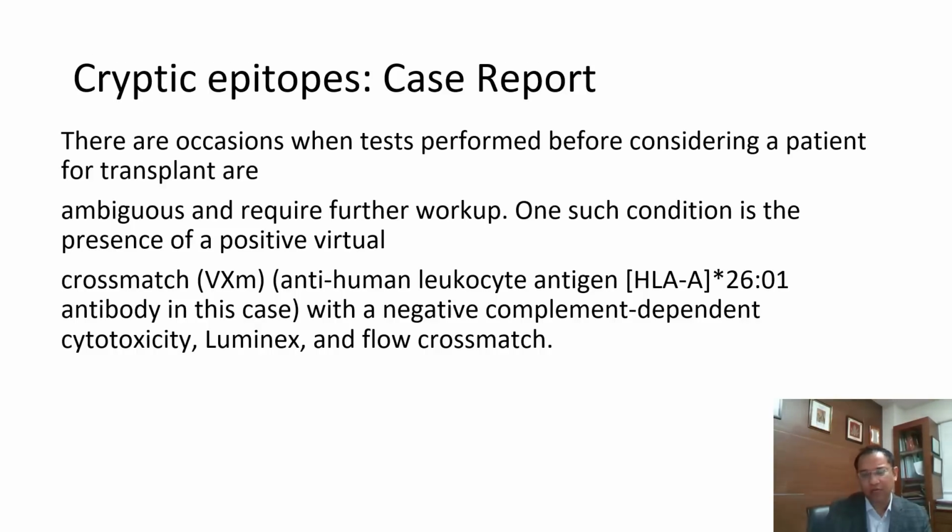And then we also saw that all the other beads were also coming positive. Many beads were coming positive, which were actually negative when you saw the flow crossmatch and other crossmatches. So we tend to look into the case. So you have to report everything in the gamut of the armamentarium that you have for testing. So it's not like you report just on single antigen bead assay.